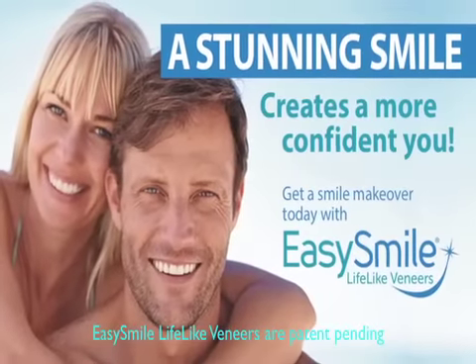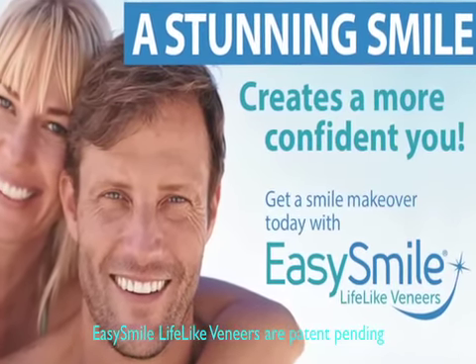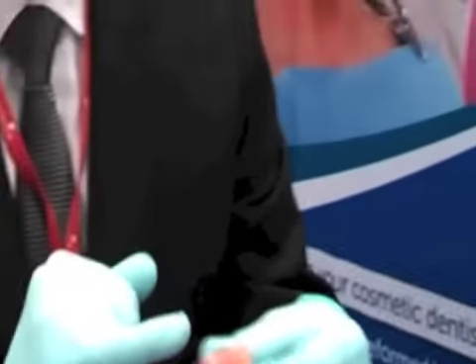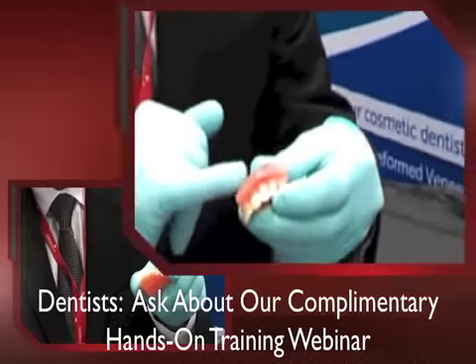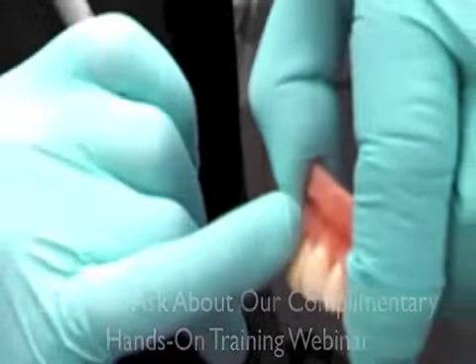Let me show you how simple this is. Here's what we're going to do. You take a little bit of this foundation material, move it down. You notice it does not stick to the glove, and it does not stick to instruments either. Next, what you want to do is create the line angles.